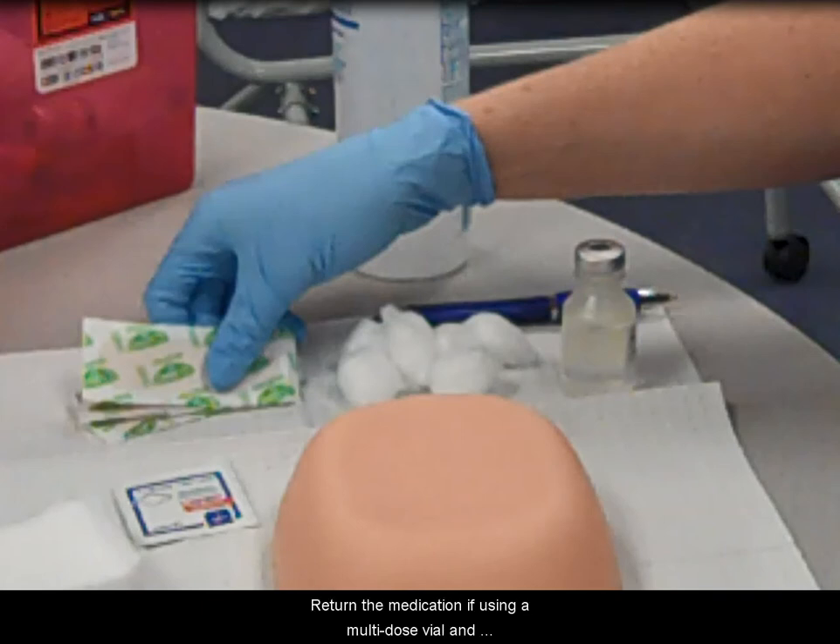Discard disposable items and gloves into a biohazard waste bag. Return the medication, if using a multi-dose vial, and tray to the proper storage area. Document the procedure in the patient's chart and ensure that you have washed your hands.